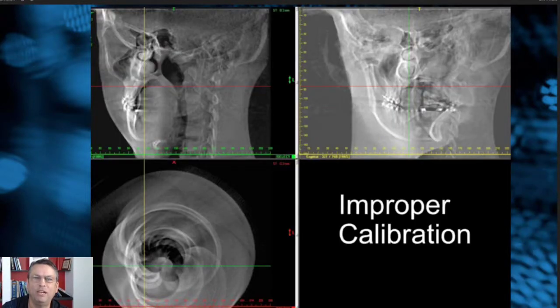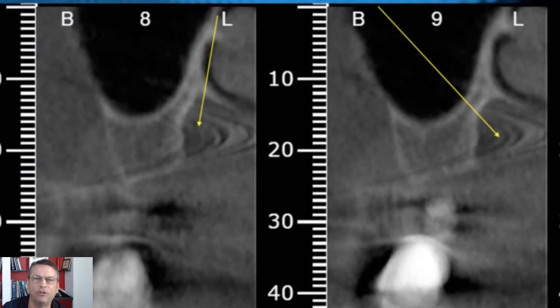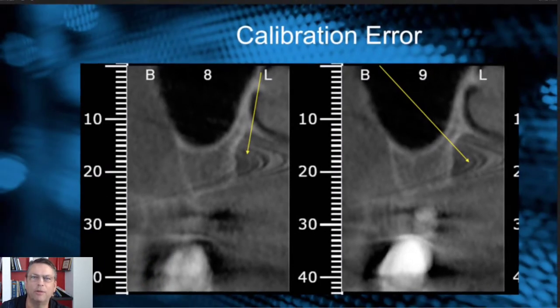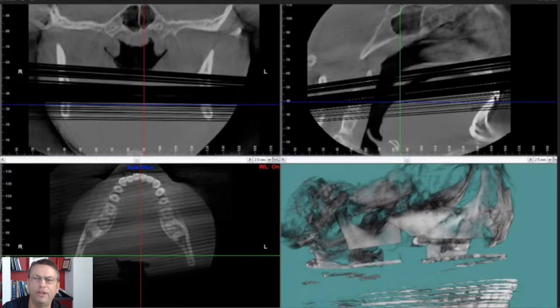I get to see cone beam CTs from all over the country, even over the world, and often I get cases that have improper calibration — such as this grossly poor calibration where a head positioner was used in the scan. Sometimes there are minor, subtle calibration issues that we don't really pick up. We get these little waves in the scan, and that's where calibration errors can come in and really affect the quality of what we're doing.